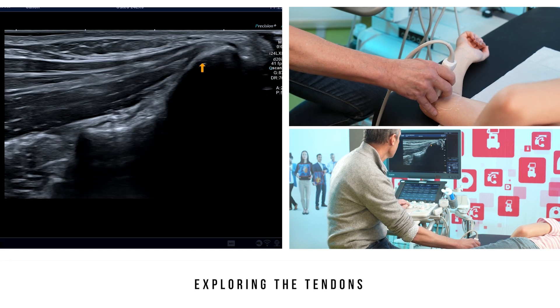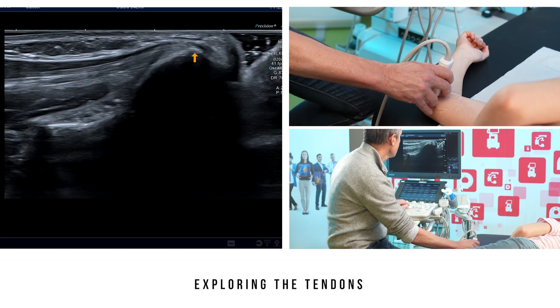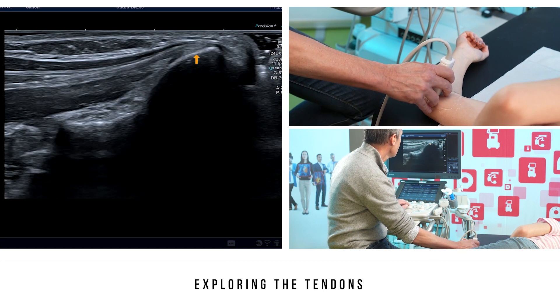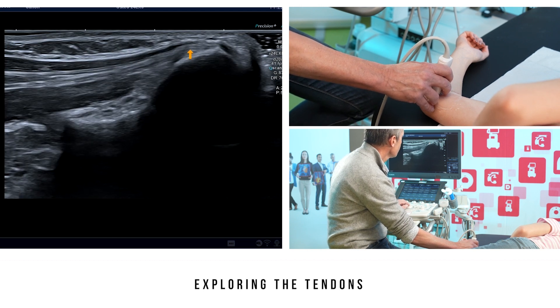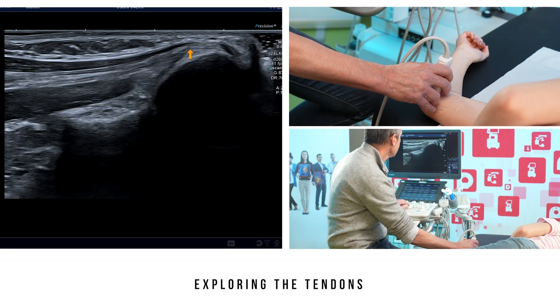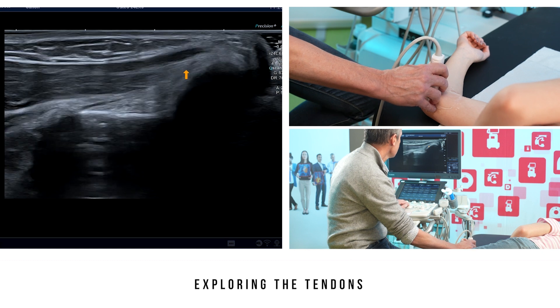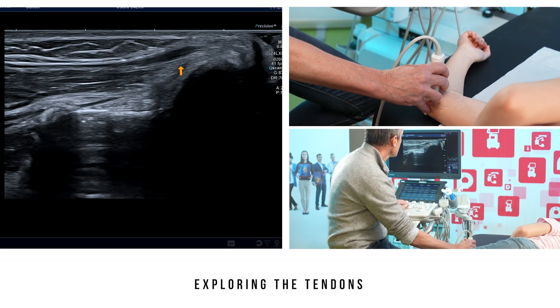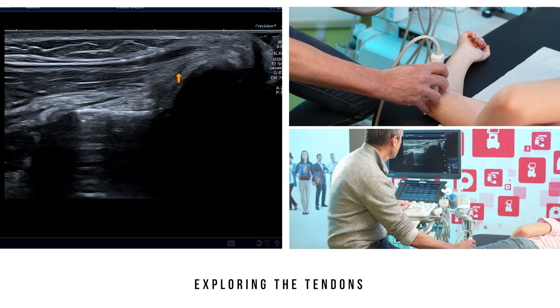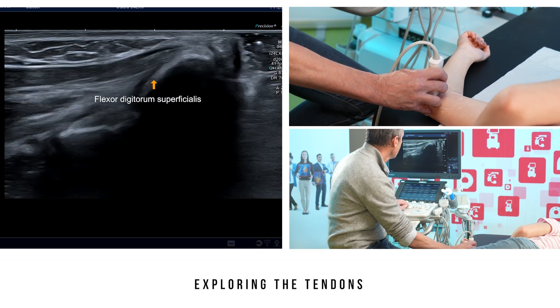If you slide the probe down, a second tendon appears that is slightly under it and more posterior. This is the tendon of the flexor carpi radialis. It is hard to differentiate between this tendon and the palmaris tendon. You can see that this tendon creeps further back. As we continue down, we arrive at the underlying tendon, which inserts fully on the medial epicondyle with a more oblique and inferior trajectory. This is the tendon of the flexor digitorum superficialis.